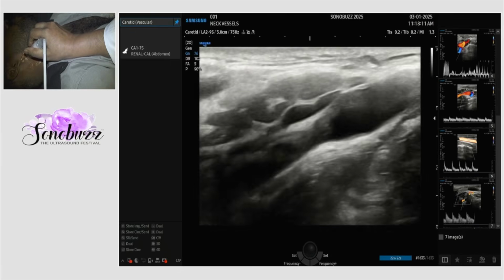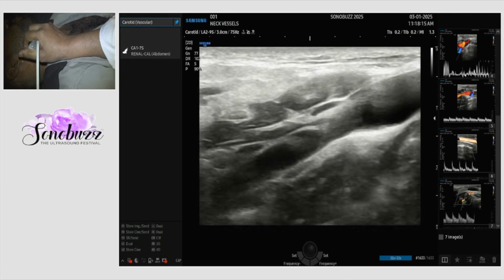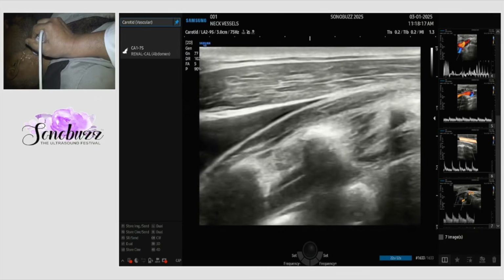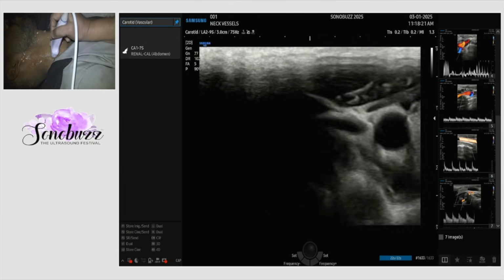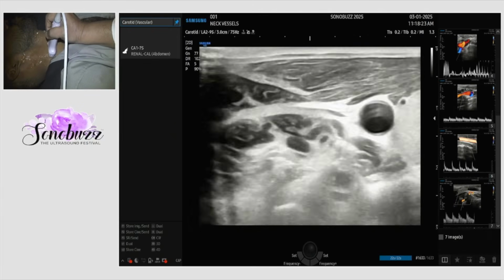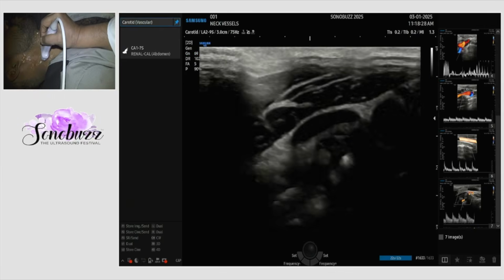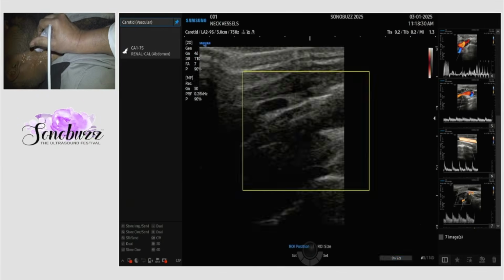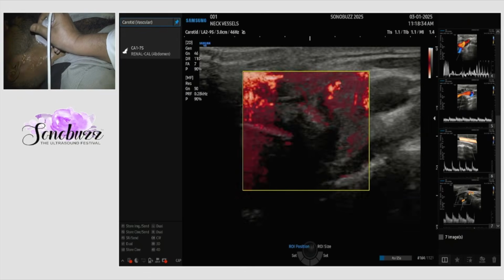At the same time you will be seeing the surface of the plaque for ulceration or any irregularities or any eddy currents which are occurring, or if there is any true ulceration within the plaque. The machines which have microvascular flow can sometimes show the flow within the plaque, the vascularity within the plaque.